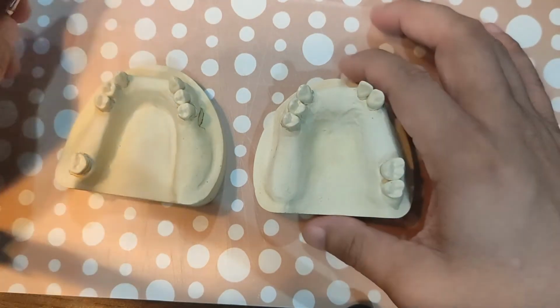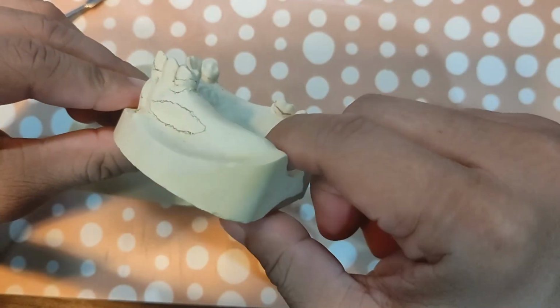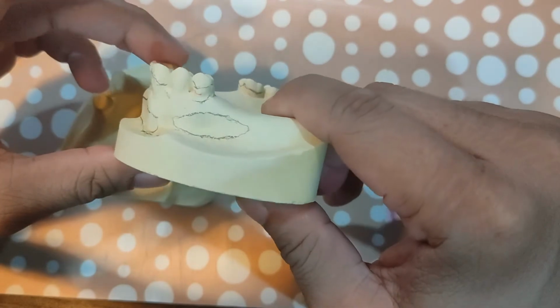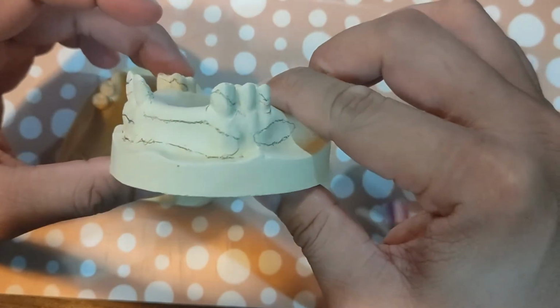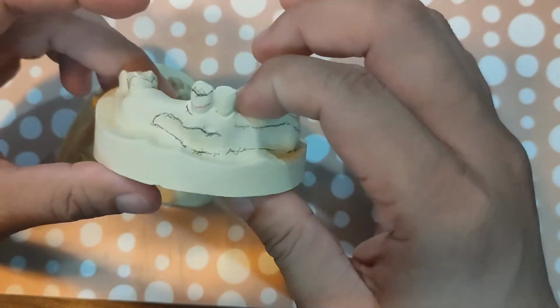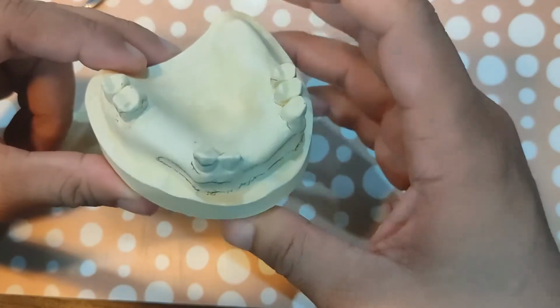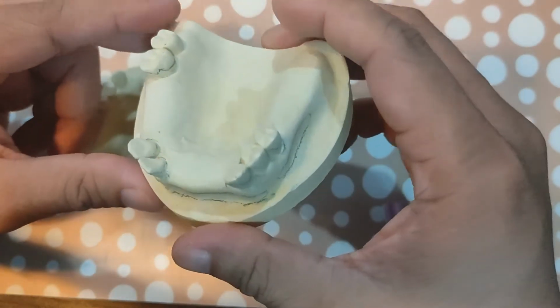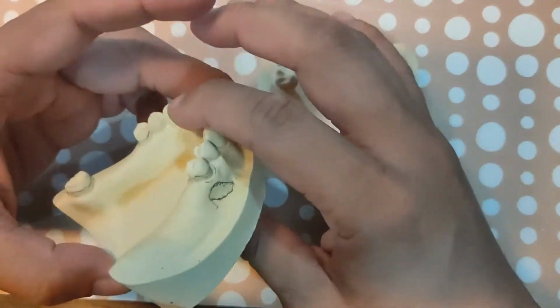Okay, so as you can see, we have our two casts here. The surveying has been completed. There's tissue undercuts, survey lines on the abutments to be used. Tissue undercuts. Alright, so that's the upper. And this is the lower.